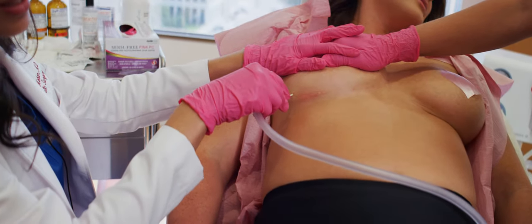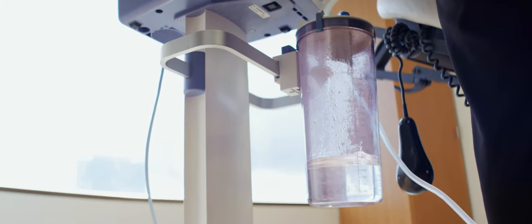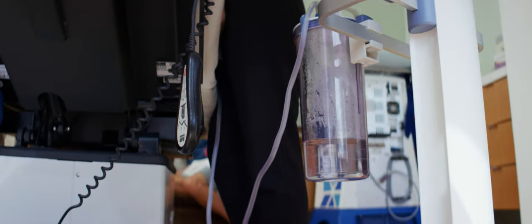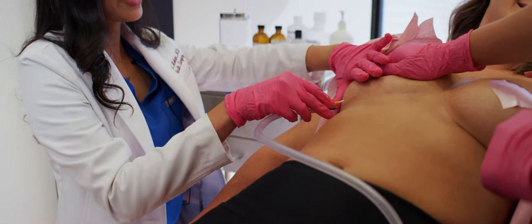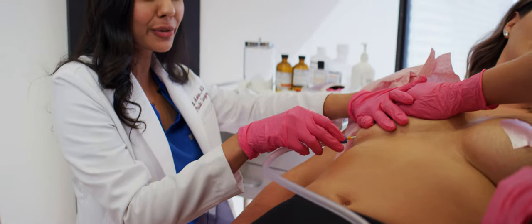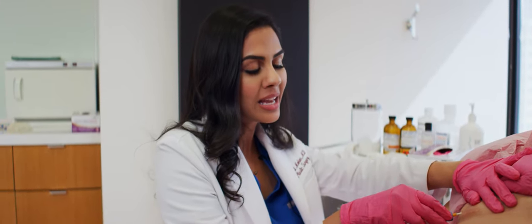You can see, even though these saline implants have been in there a long time, it's nice, sterile fluid — very easy, nice and clear, all flowing out. Our patient, you can see she didn't even flinch. She did fantastic. We're just holding some mild pressure so that we can get all of that fluid out of the saline implant. Now that saline bag isn't going to have any fluid in it and her little pocket in there can shrink.